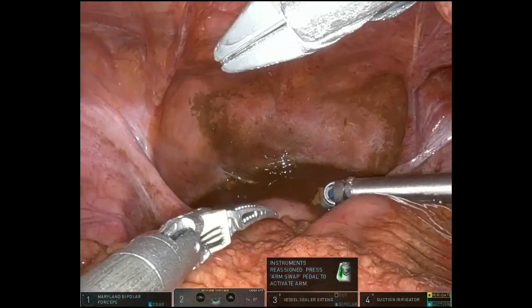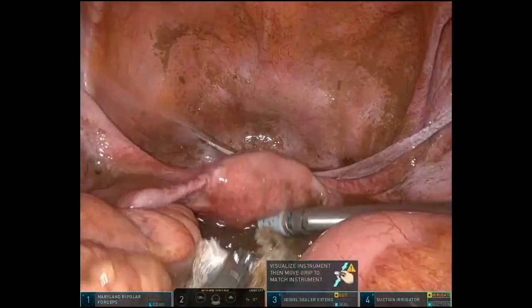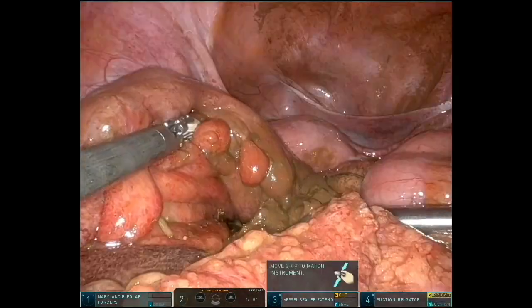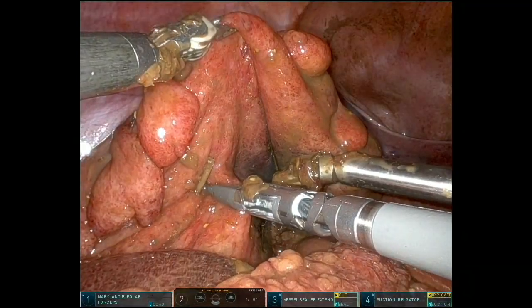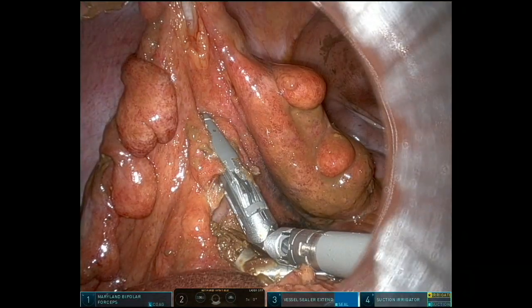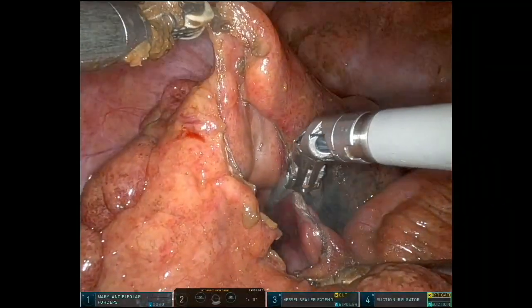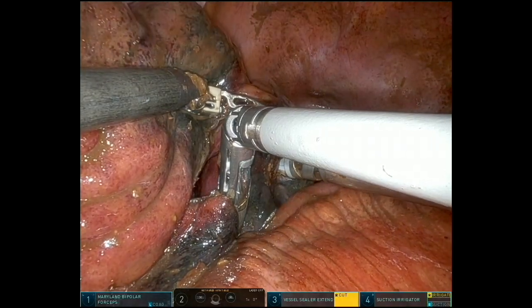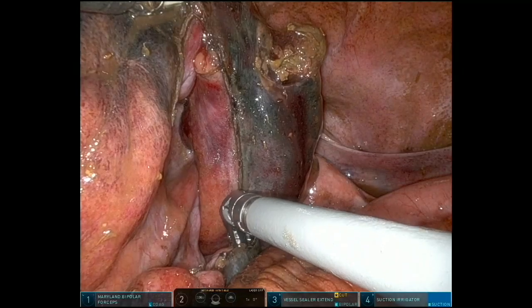Upon exploring the abdominal cavity, we noted a fair amount of feculent and fluid material related to a perforated sigmoid diverticulitis. Utilizing a total robotic approach, we retracted the colon, followed by using the vessel sealer to divide the mesentery in proximity to the colon and marching towards the recto-sigmoid junction.